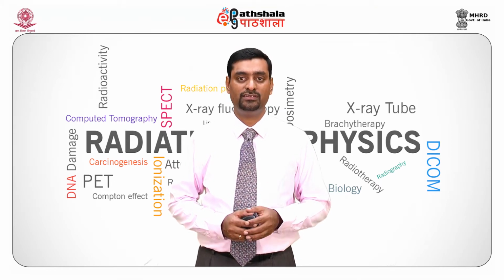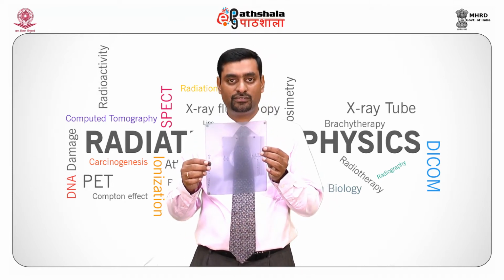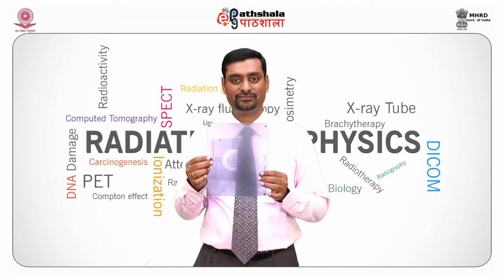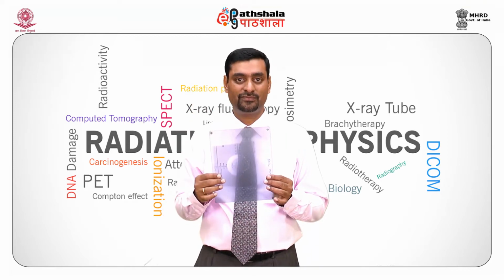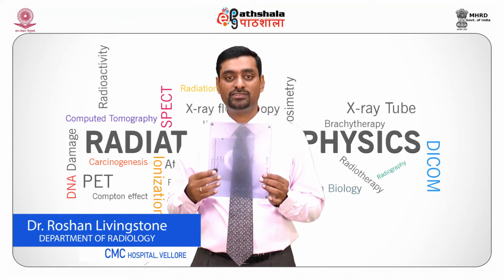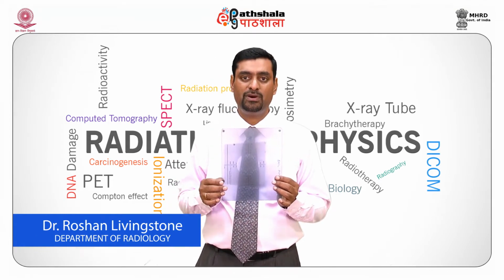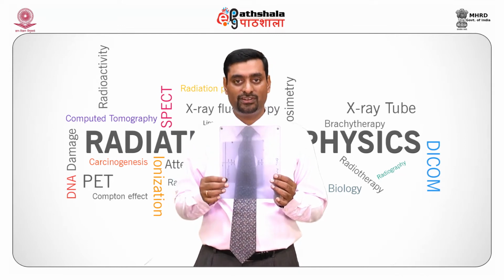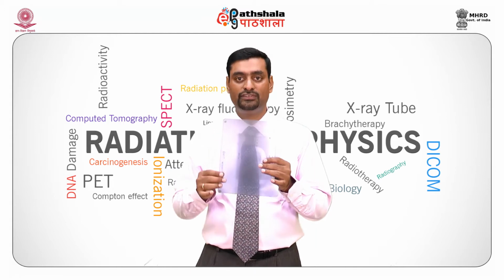How are we going to see? Using a film. This is a radiographic film, and this has emulsion on both sides. In some cases, we see the emulsion is on only one side. If the emulsion is only on one side, it can be used for mammography purposes. But mostly we see images obtained using duplitized films. That means emulsion is applied on both sides of this film.